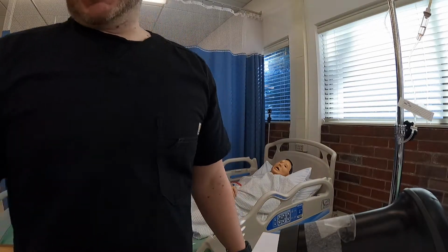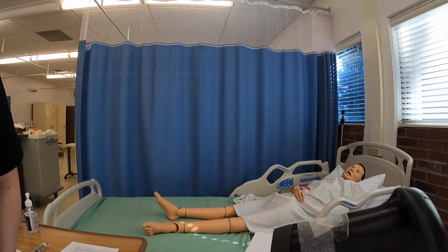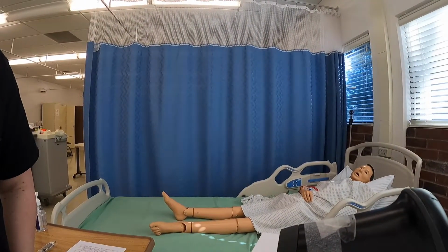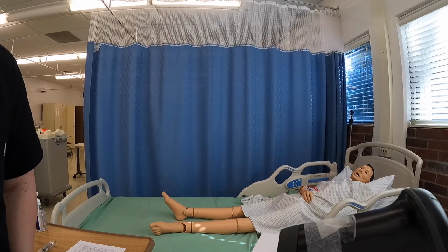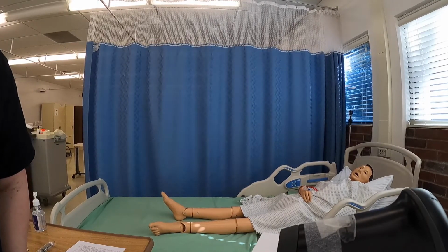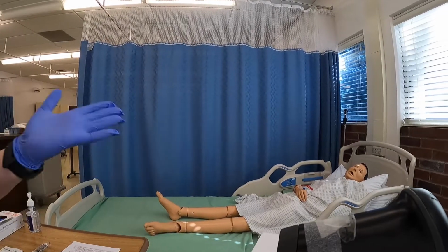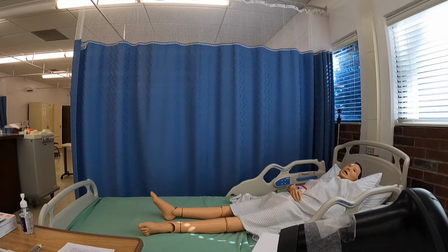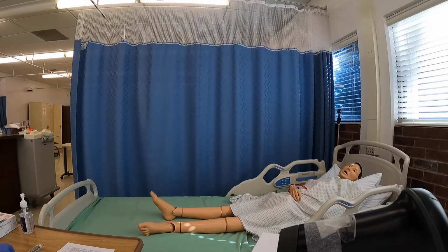And then I'm going to compare that with my chart. And this is my second check of my medication. So now I'm in my EMR. And it looks like I have that sodium chloride. And we're going to run at 100 mils per hour. And it's 1 liter, which is what I have. So now I'm going to explain to Mr. Covey that his doctor has ordered this medication for him. Give any patient education that's needed.